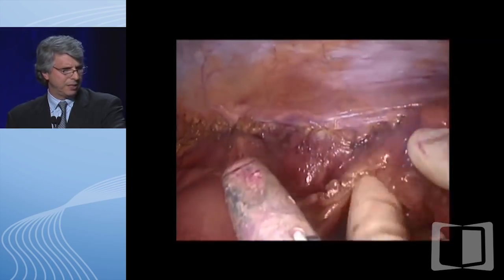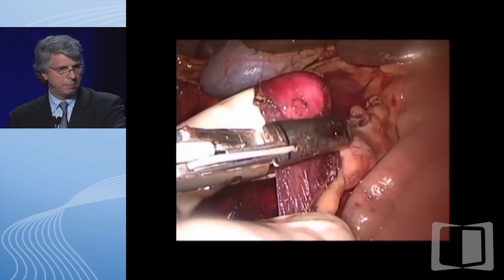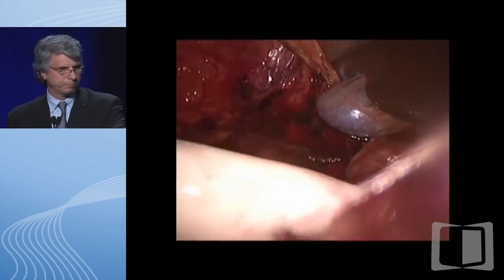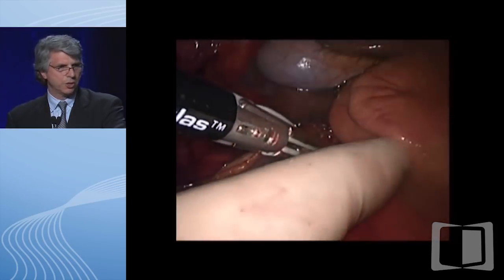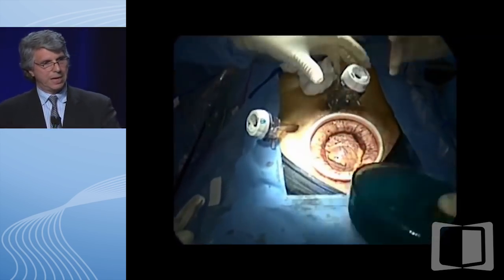So we've now dissected the mesentery, and we're now taking the mesentery of the colon—this is now beyond the point of no return. We start taking the mesentery of the hepatic flexure, coming across while watching the duodenum. As we're doing this, we're obviously making sure that the small bowel is not injured. Basically, the colon has been mobilized.